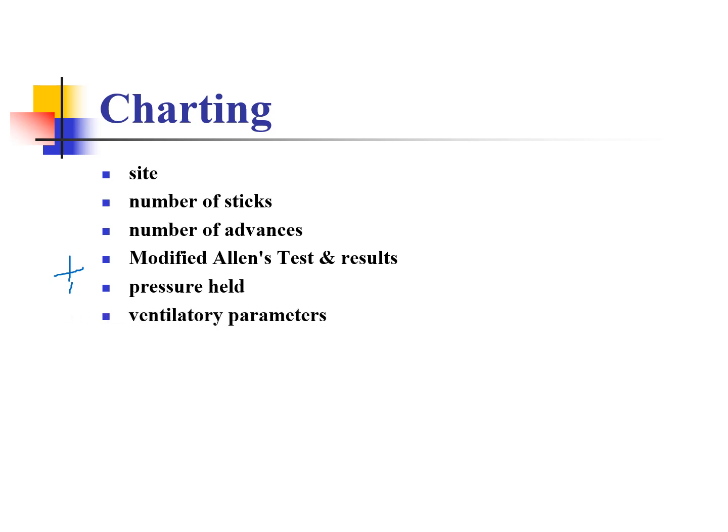Chart how much pressure and FiO2 they're on, whether on the ventilator or on the CPAP or BiPAP machine. So we know exactly what was going on when this patient did this. So pressure, FiO2. If they're on a nasal cannula at 3 liters, remember our rule of 4: 21, so 24 would be 1 liter, 28 would be 2 liters, 32 would be 3 liters, right? So you chart that at 0.32.